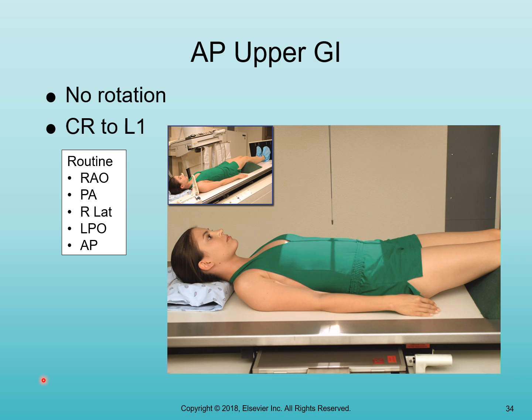One goes on the lower border of the ribs, the other one goes on the xiphoid process, and you put your two thumbs together, and that forms your W. Okay, I know it sounds weird. I can't really show you it, but if you watch the positioning videos, you will see what I mean, and it does work.